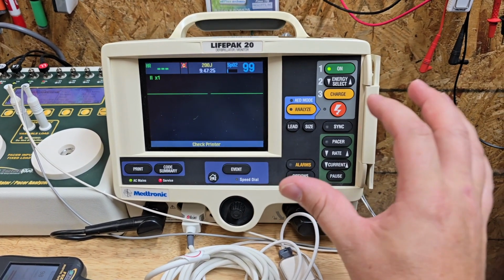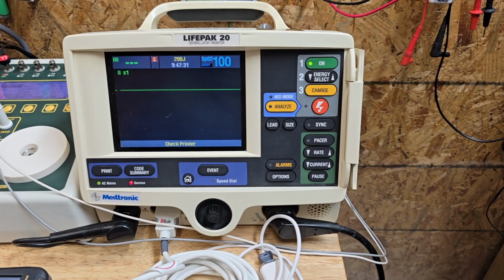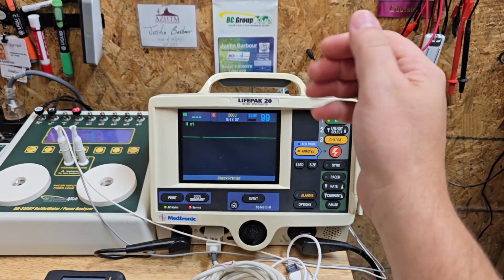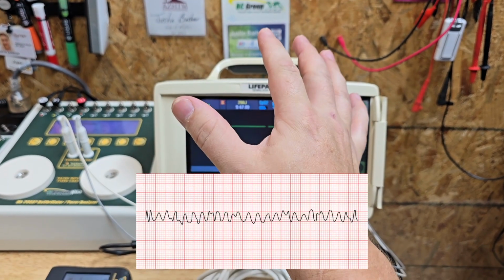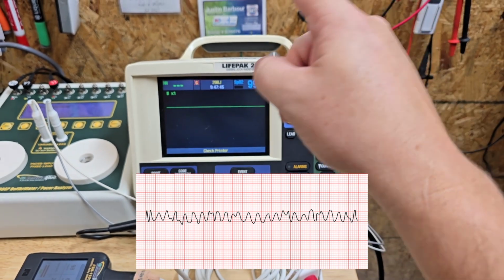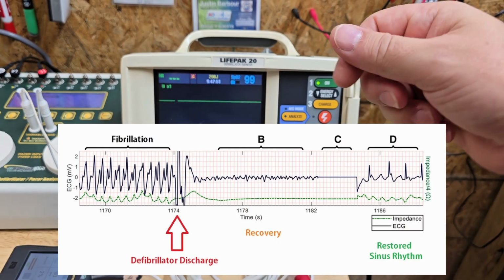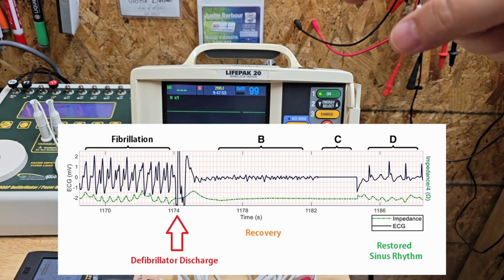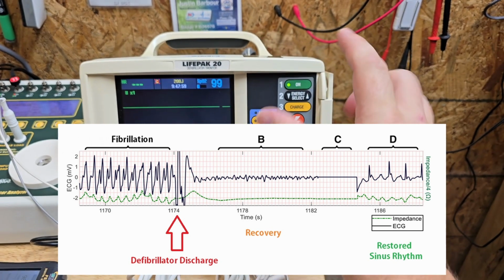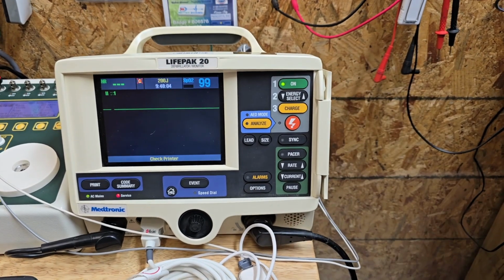And that is because pacing is the actual controlling of the heart. A lot of people think that defibrillation is the controlling of the heart, when actually defibrillation is when your heart is sitting there and it's quivering. That is fibrillation. When it's fibrillating, the heart is quivering and it has an irregular electrical signal. What we want to do is reestablish a baseline and reset it. And that's what you're doing. You're injecting and pulling out voltage across the chest cavity, and that hopefully resets the heart and allows it to establish a normal QRS complex. But it doesn't always happen.